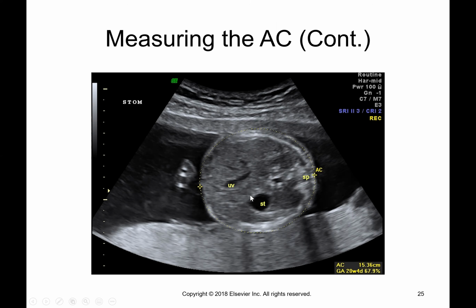This black hole right here is the stomach. This is the umbilical vein. This is the liver right here. And the measurement goes all the way around, kind of including the skin.